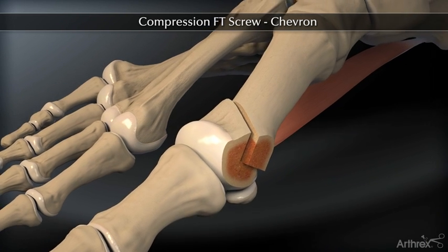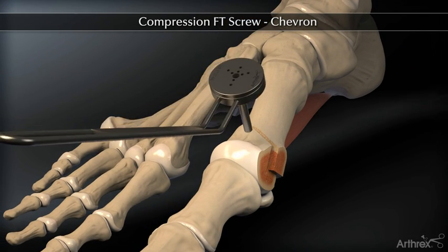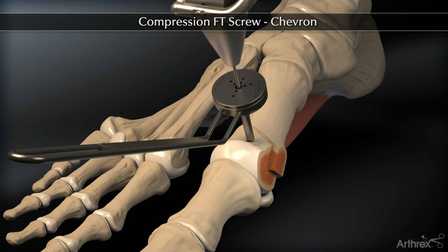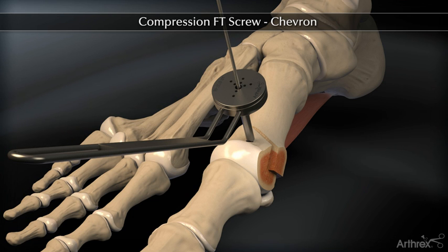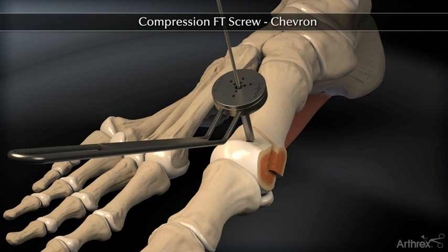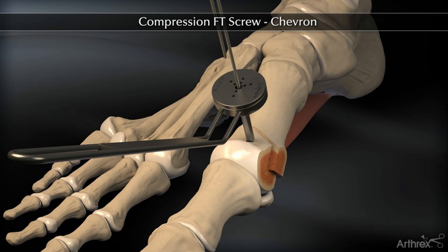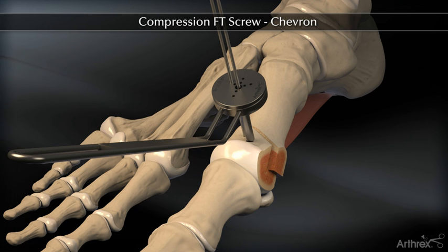Lateralize the osteotomy to the desired correction and insert a .034 K wire from dorsal to plantar. Make sure the K wire is bicortical to ensure accurate measurement. Verify bone correction and K wire placement on fluoro. Insert a second .034 K wire using the parallel drill guide for rotational stability.